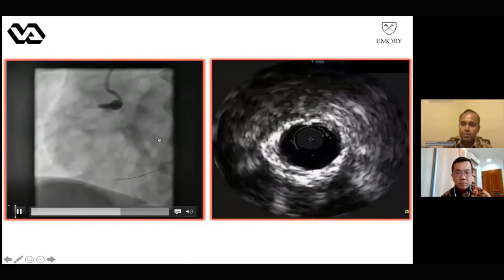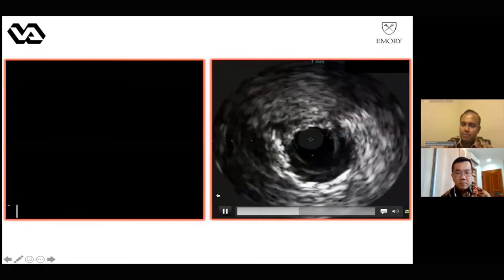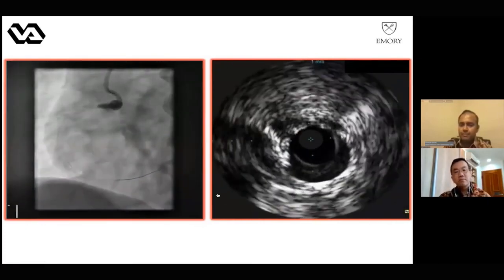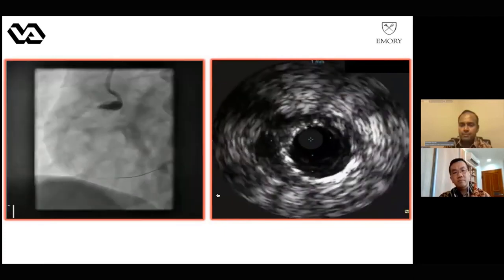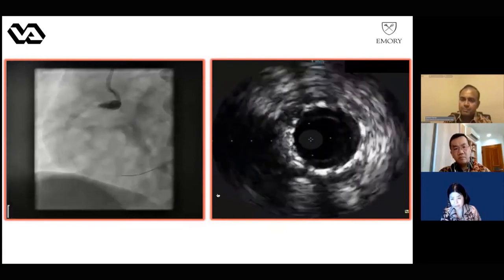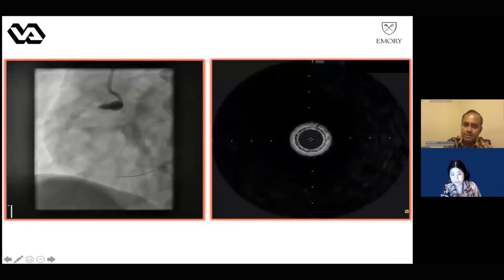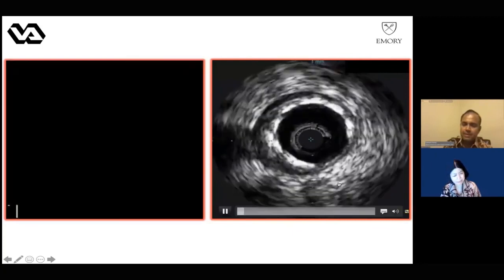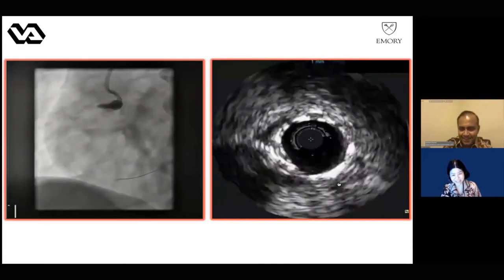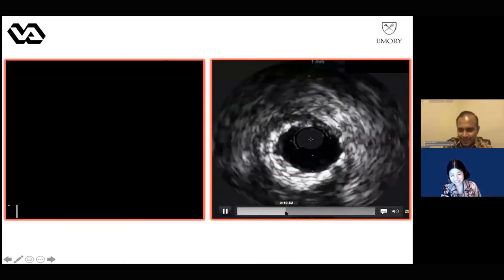And Prof. Akiko, again, you can comment on the IVUS that is performed through that proximal stent now. Yep. So as I said in my presentation, what is important is you really have to confirm the ostium was well covered. Now it's close to the ostium. And you see some outside, oops. Yeah, I see some hematoma at the very last frame. Yes, can you go to the very last frame? I think I saw that too.